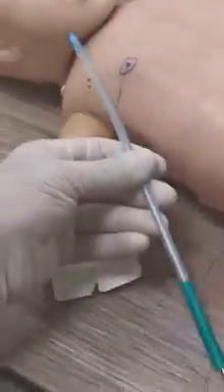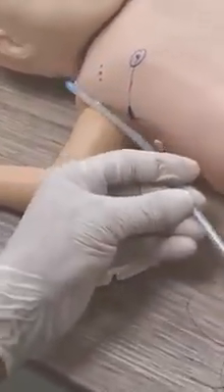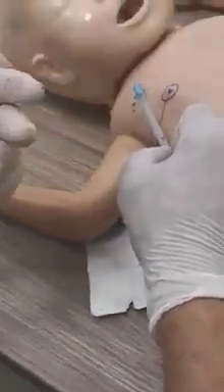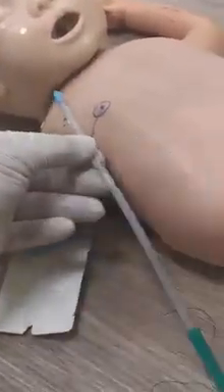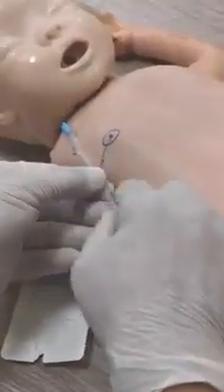After insertion, very important, of course we remove the trocar and connect to the underwater seal, whatever. After insertion, you should do something else. Always, because sometimes the patient is edematous, sometimes the patient is septic, sometimes you are junior, you don't know that maybe you passed subcutaneously. After insertion, always don't forget to palpate the chest tube on the chest, because sometimes you will go subcutaneously. If not, you are okay, you can see the underwater seal bubbling, or you can see oscillation of the chest tube.